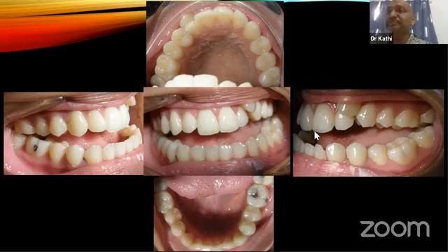So in this case, the excess is in the lower 1/3. The upper 1/3 is fine, but the lower 1/3 is excessive. So he would have a better appearance if he went for some genioplasty, reduction of the chin. The occlusion is sorted.